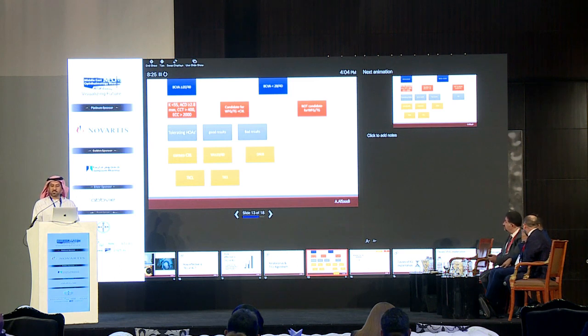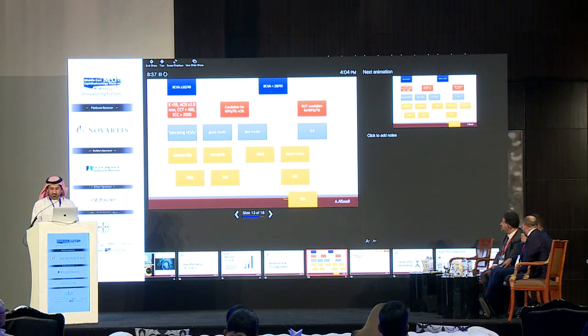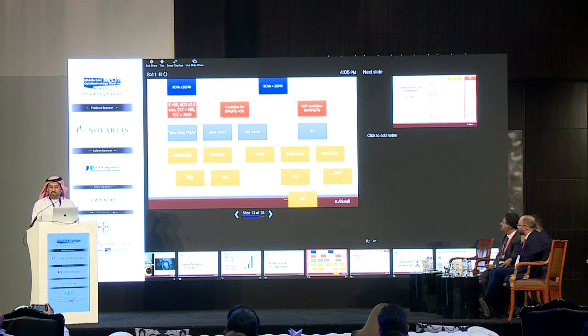If the patient was not a good candidate for wavefront-guided or topo-guided treatment, then you can consider ICRS, intrastromal corneal rings. And if they get a good result, then you can implant the TICL, which we have done frequently after cross-linking them. If it was a bad result, again, they will go to deep anterior lamellar keratoplasty. And this is what I practice.